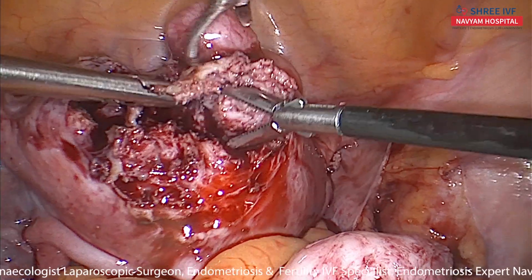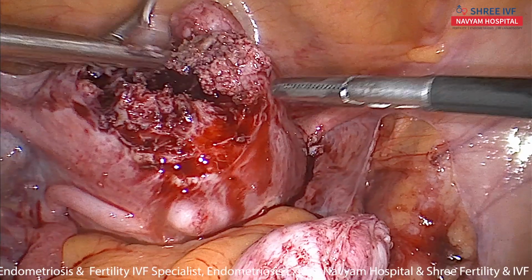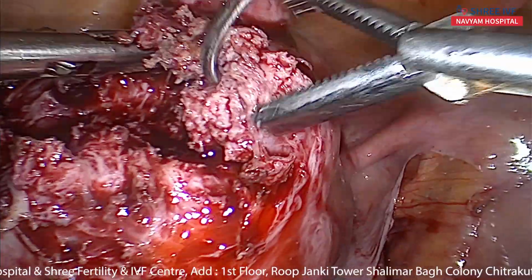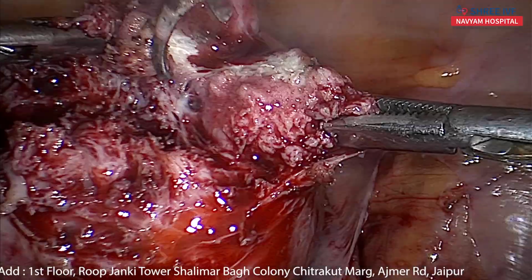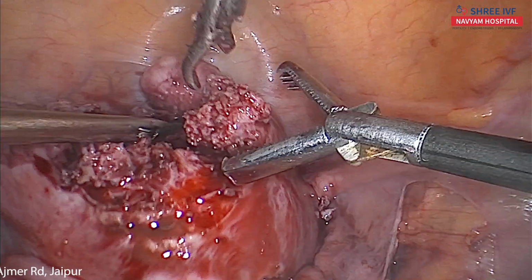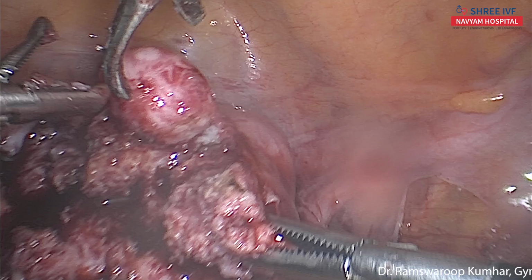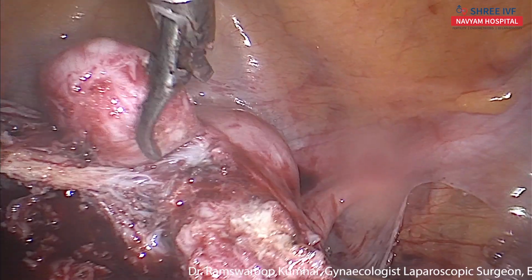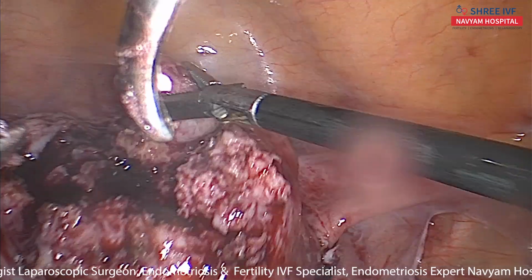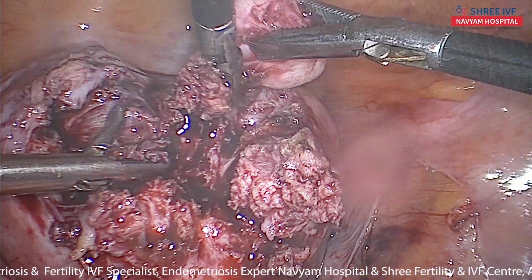So I have to sacrifice this little of the serosa. This part of serosa is being sacrificed. All that myoma. This is again a subserosal myoma.